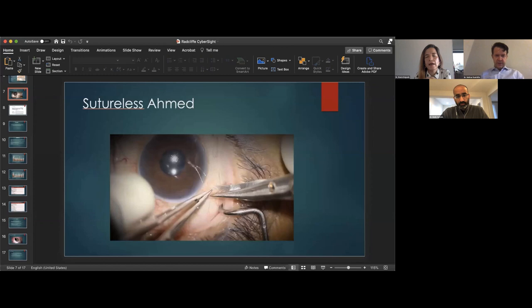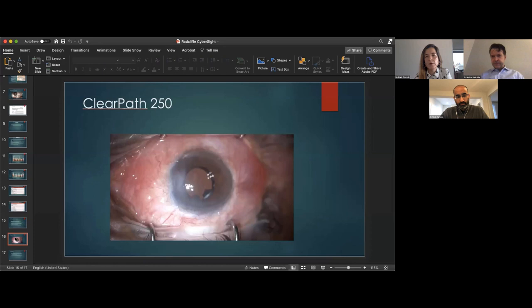Yeah, I had a question. When you mentioned that your conjunctival incision is 6 millimeters behind, is that because you need that conge to, of course, glue? I mean, you would not be able to do this at the limbus, right? I think that's right. Actually, in one of the videos you showed where you put your scleral patch graft down, my mouth started watering because I wanted to put the glue. And it would have worked in that case.